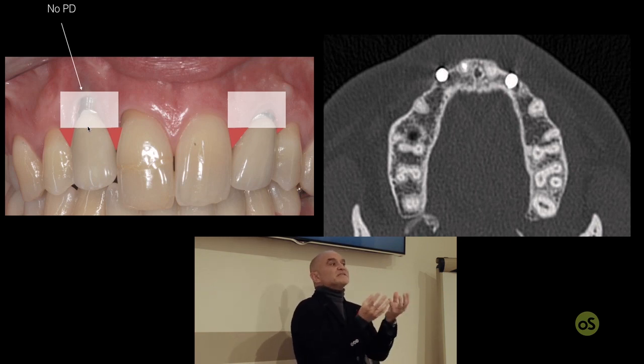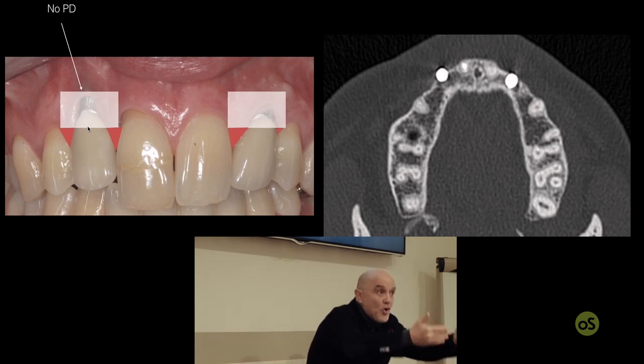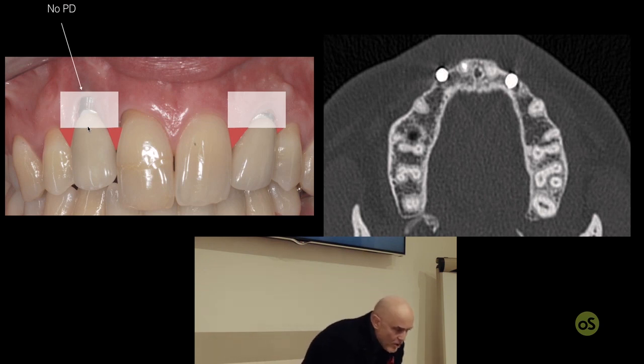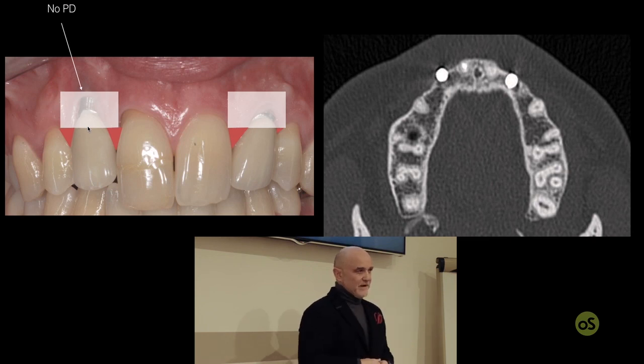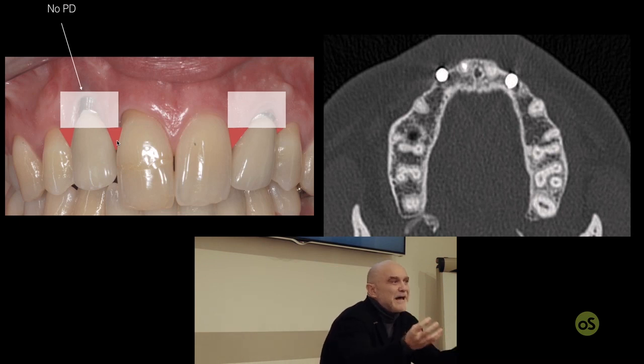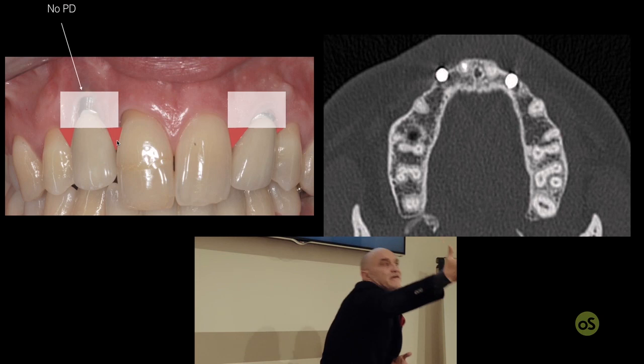You need to give some blood supply to the flap in a more coronal position with respect to where you place your graft. And the only vascular area coronal to the connective tissue graft is the area of this papilla. But how are these papilla? Very weak. Why? Because they don't have the same intact bone peak of the teeth. They are very, very palatally displaced. Not because the papilla is palatally displaced, but because the crown is extremely buccal.